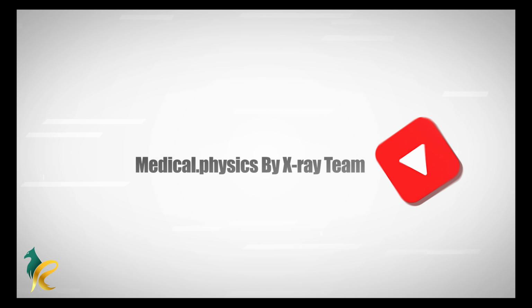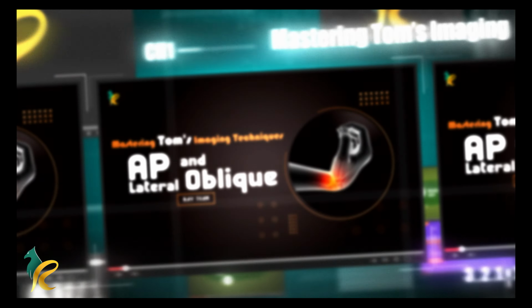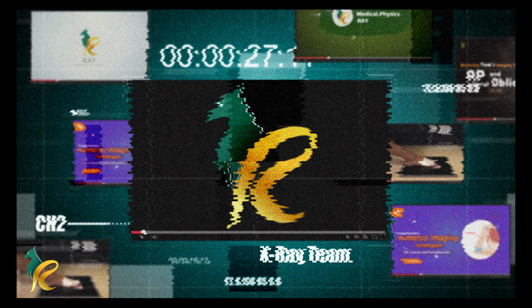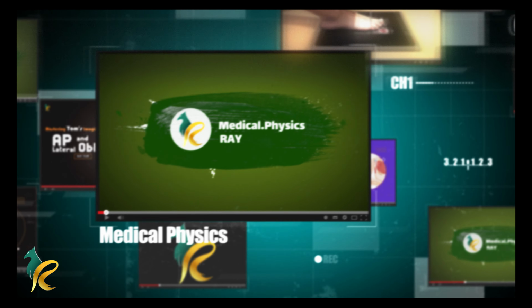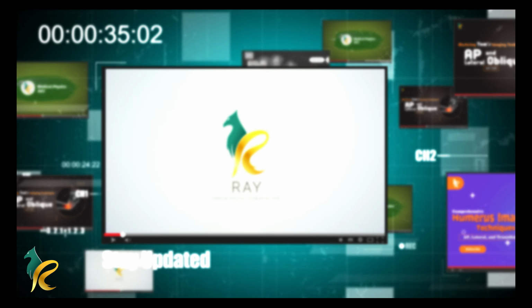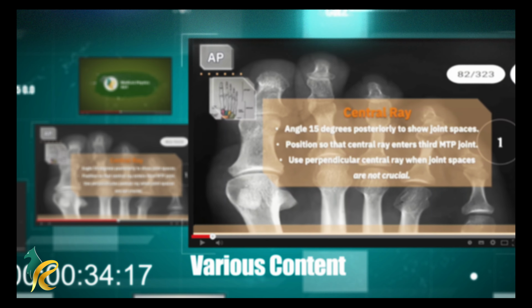If you've ever wondered how to get perfect X-ray images of the foot, you are in the right place. Hello. Welcome to our radiography tutorial series. In today's video, we'll be exploring the essential radiographic techniques for imaging the toes. Whether you're a radiography student or a professional, this guide will enhance your imaging skills and precision.